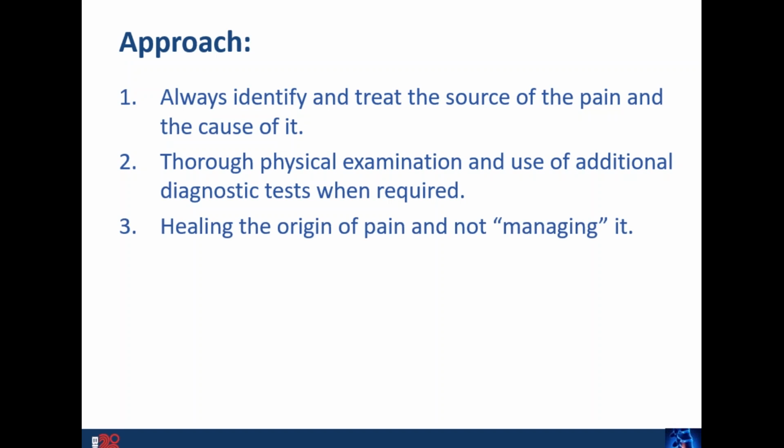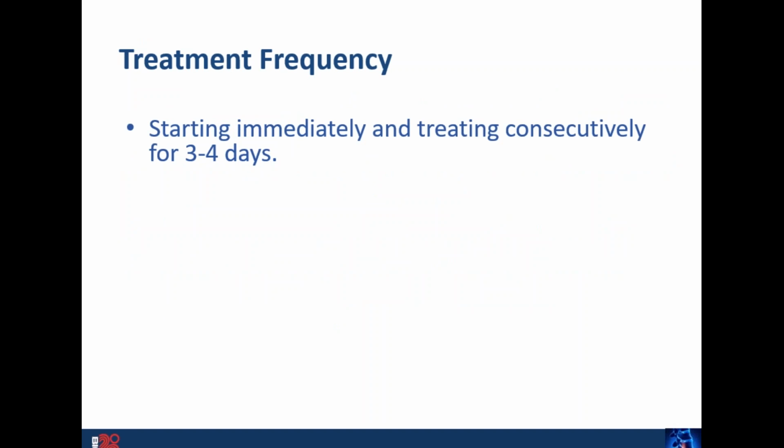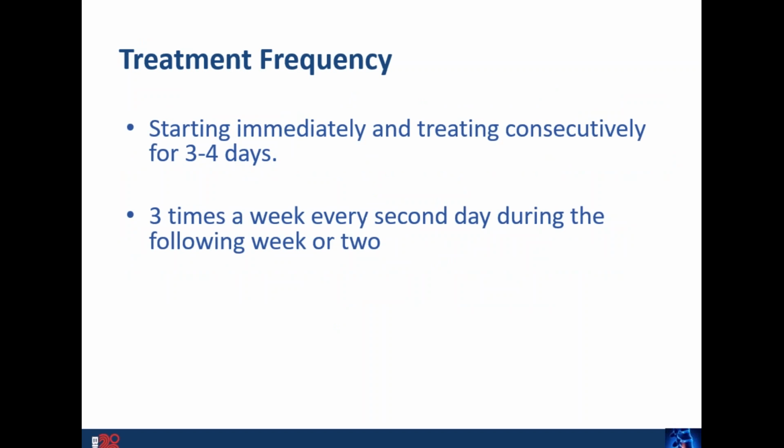So again, you're trying to treat the disc area. You're not just trying to block the pain temporarily. So after initiation of laser therapy, you want to avoid any long-term complications. So the sooner you can do laser therapy treatment, the better prognosis for your patient. So remember, healing first, get things going before you start to engage in any exercises, especially ones that may potentially aggravate the condition. So we want to start immediately, and usually we start treating 3 to 4 days consecutively.